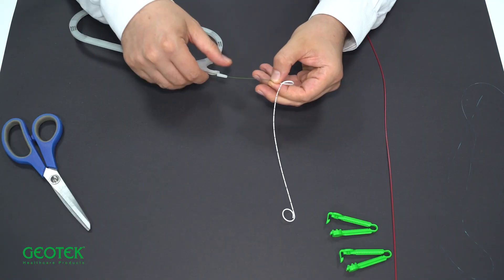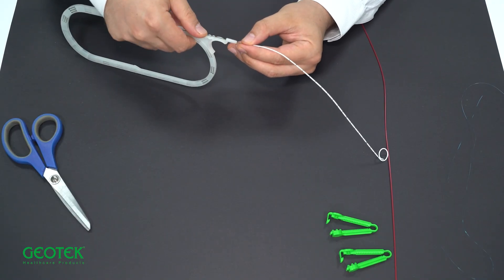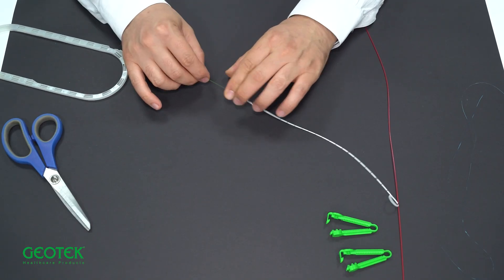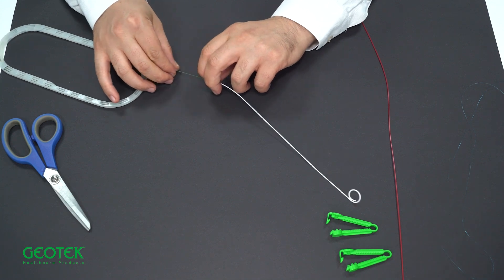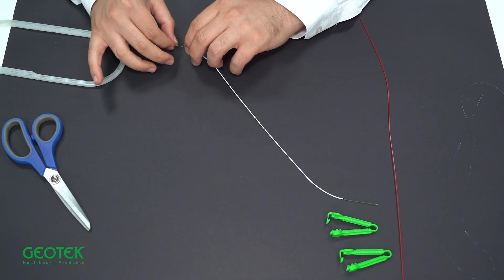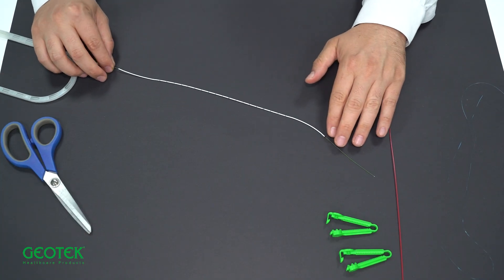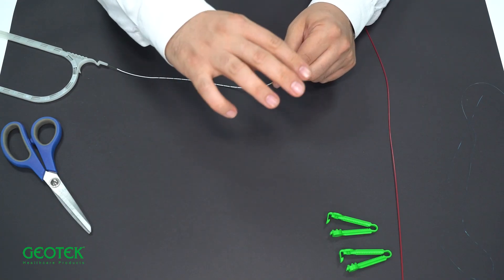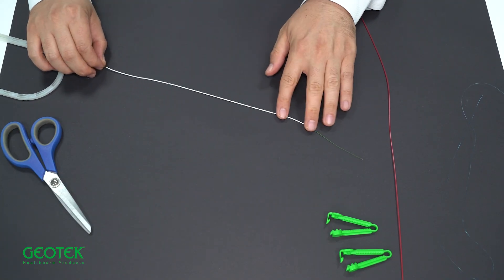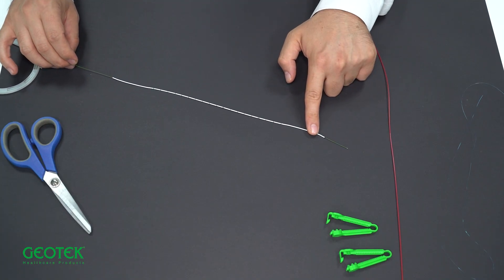After placing our guide, you can also use this part if you wish while advancing the double J stent. Our stent will flatten as we advance it. In open-ended stents, when you advance the guide completely, the stent will become flat and connected to the guide. The soft end of the guide will remain in front of the stent. In this way, when the stent advanced from the collecting system reaches its place, the guide can be slowly withdrawn, and the stent can be left with one end in the kidney and one end in the bladder.